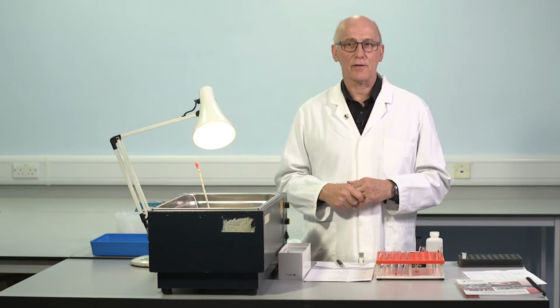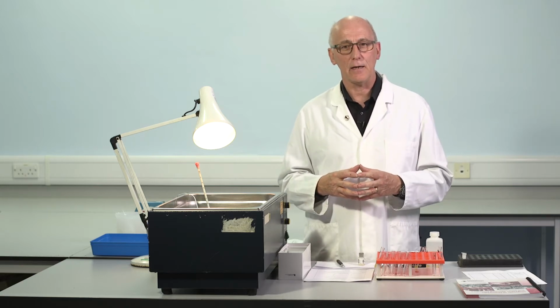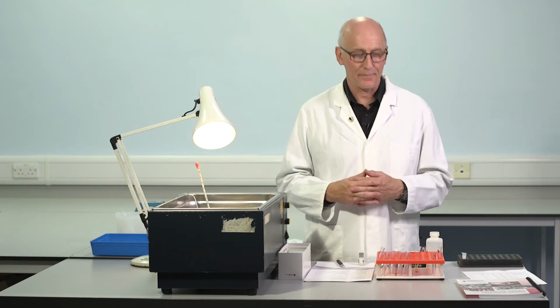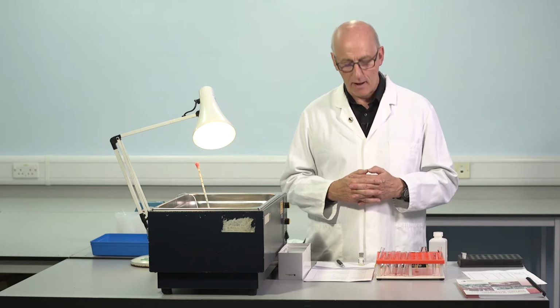At the moment, the majority of centres from surveys of practice are making all the dilutions in a buffer, and we'll be doing that today. We'll be using an Owren's buffer, pH 7.35.